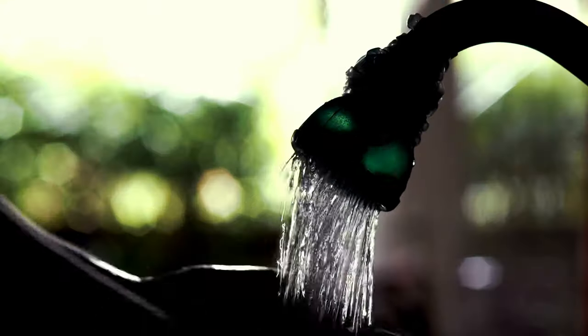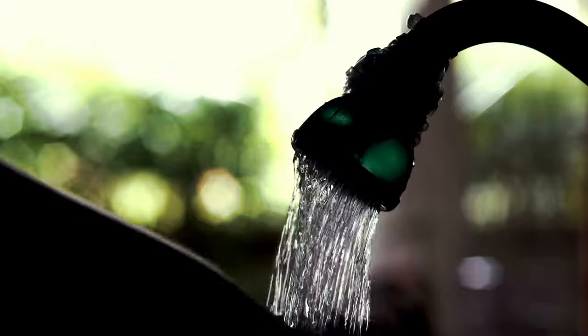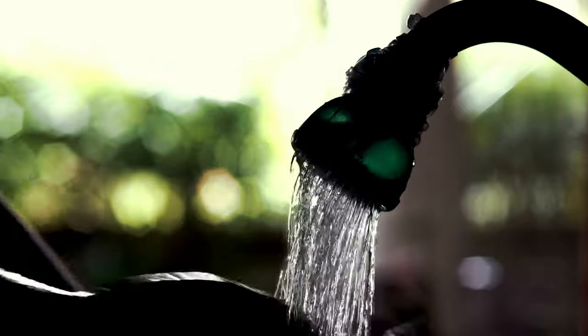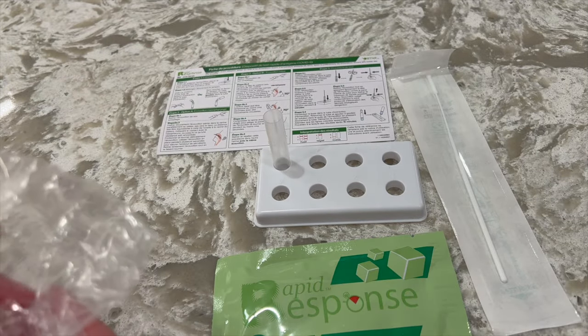To complete an at-home rapid antigen test, first be sure that you have washed your hands and washed the surface of the counter area that you are using. Start by placing the extraction tube into the test tube rack.